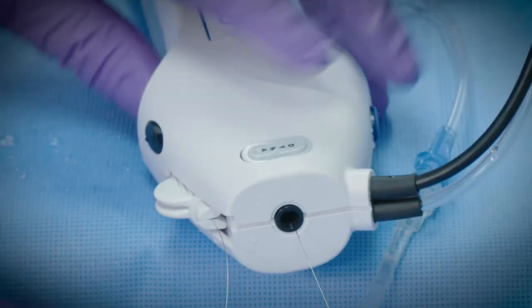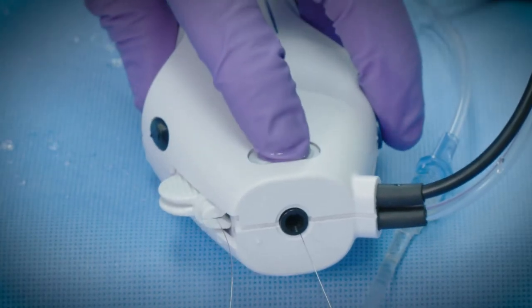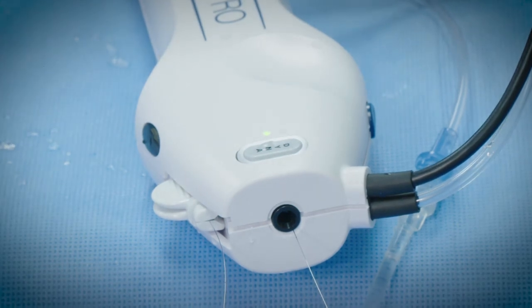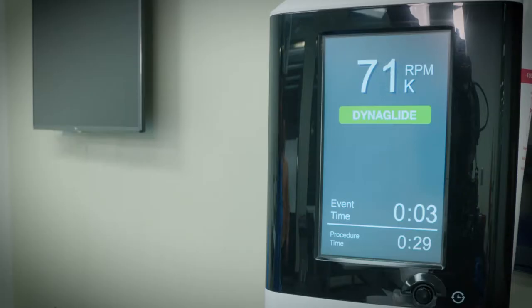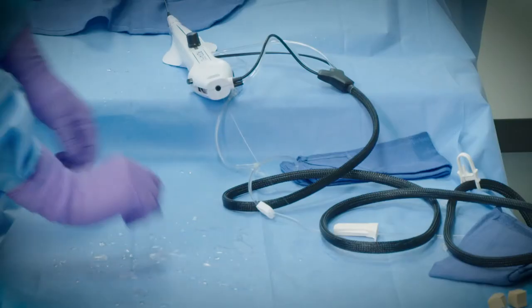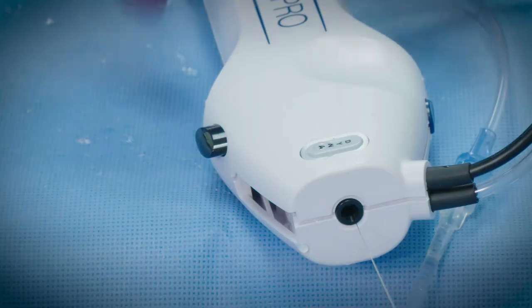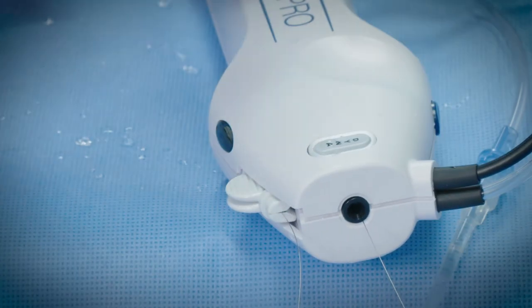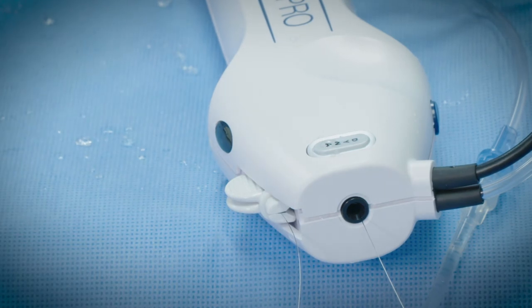When you are finished with the procedure, remove the Rotopro burr catheter by first depressing the DynaGlide mode button. The DynaGlide indicator on the console front panel and on the advancer will illuminate. With the wire clip torker in the docking port, depress the brake defeat button and push forward on the torker until it stops, locking the brake defeat button in the depressed position. This eliminates the need to hold the brake defeat button manually.